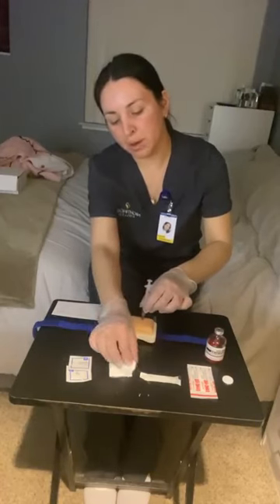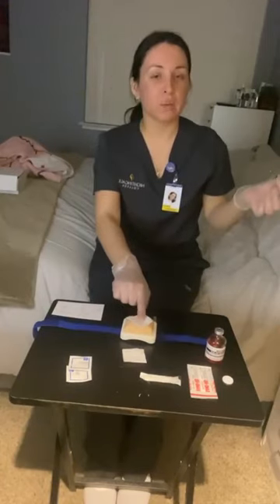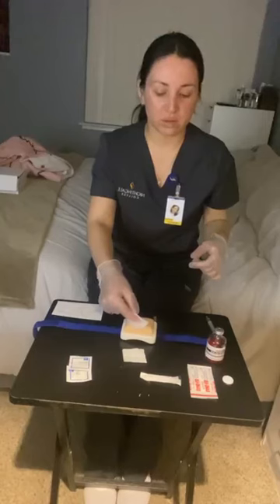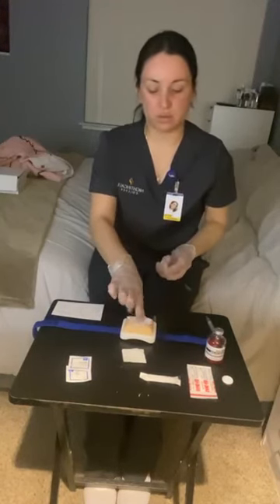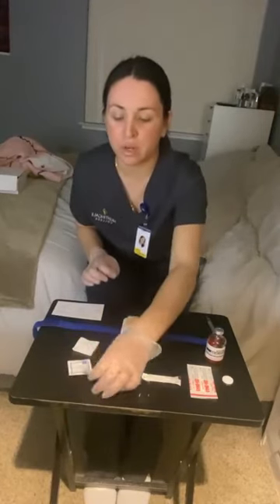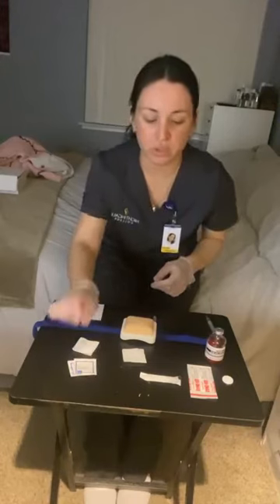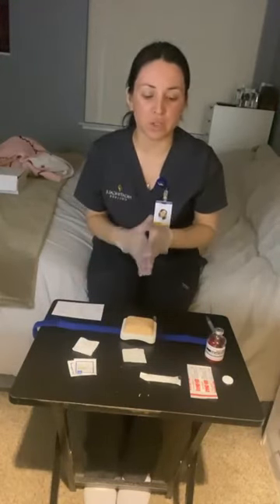And I would grab gauze and quickly release that needle, place it into the sharps container. I would apply pressure for 10 seconds. Remove that gauze. I would clean that area with another alcohol swab, starting from the center, working outwards about 2 inches. I would place a Band-Aid if they're not allergic to adhesive bandages.